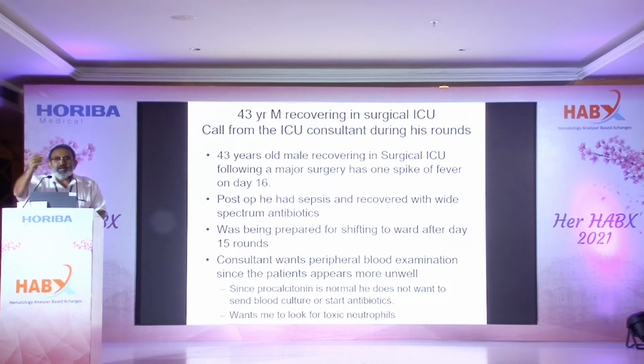So he had sent the counts as usual and the procalcitonin. Procalcitonin comes as normal. So he calls me and says that, Sukesh, I think this person looks a little sick. Procal has come as normal, he's afebrile. Can you look at the peripheral smear and say whether this guy's got toxic granules? You know, our guys have got so much confidence in the morphology of toxic granules. Can you look at toxic granules and tell me whether it's toxic granules?